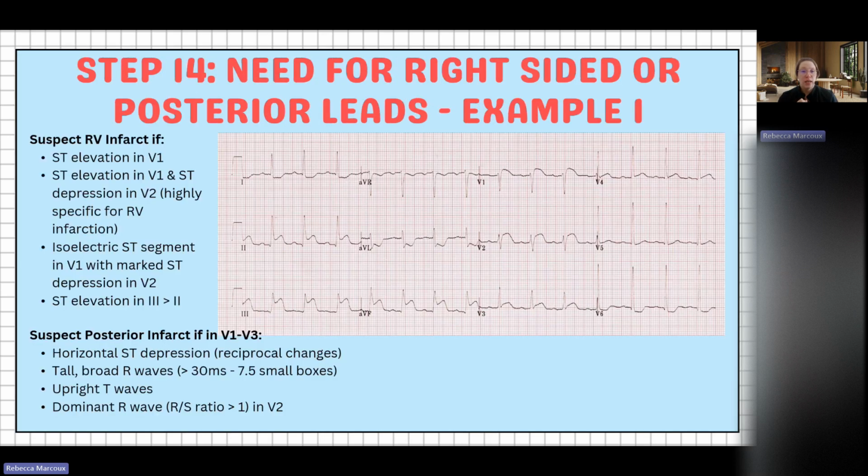The first thing I want you to look at, which might be hard to see, is in the booklet with the rhythms that I sent today if you were previously registered, which is probably easier to see. The first thing I wanted to do is look at this 12 lead and tell me if there's a reason to do an RV ECG or posterior leads for any reason. You can just put it in the chat.